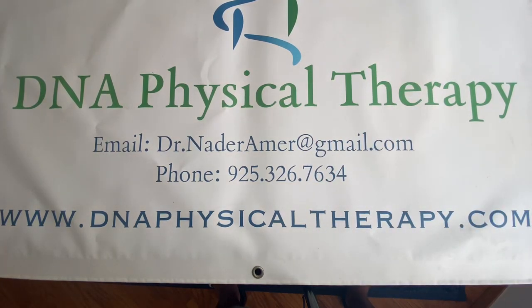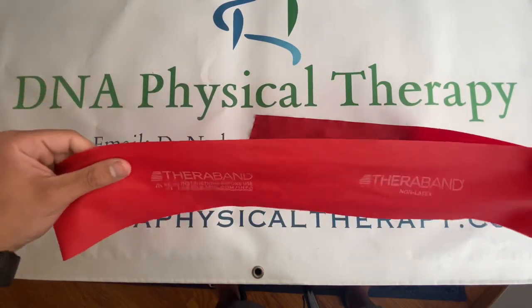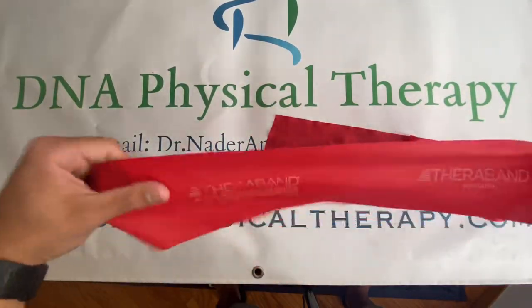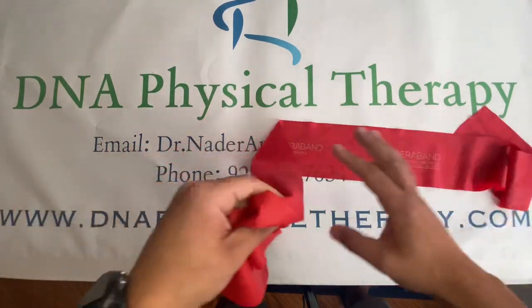Heyo! Dr. Nader Ammer with DNA Physical Therapy. Today we're talking about TheraBand and how to tie it. We're going to tie a loop at one end and a knot at the other. Let's begin.